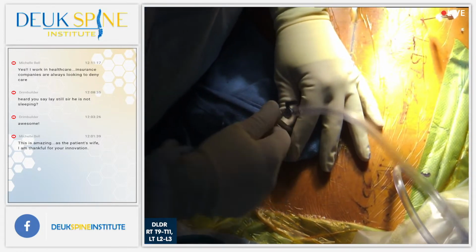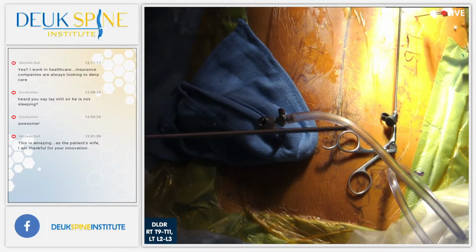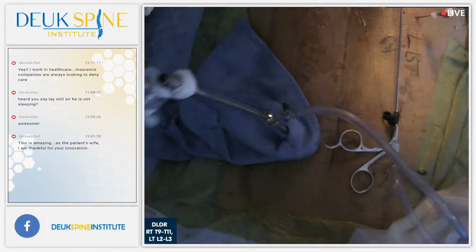Okay? What we don't want is our patient to move around too much and fall off the table or, you know, have some kind of injury from the instruments we're putting in.